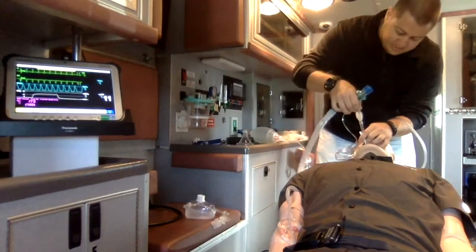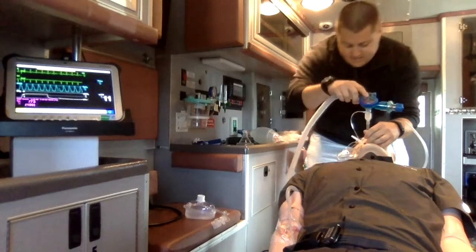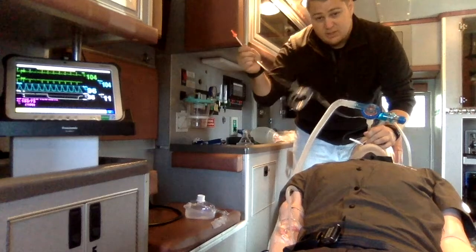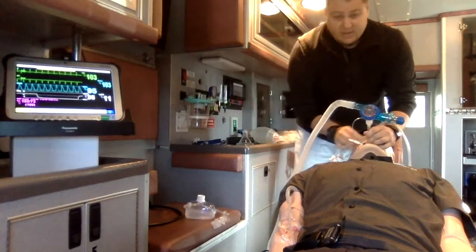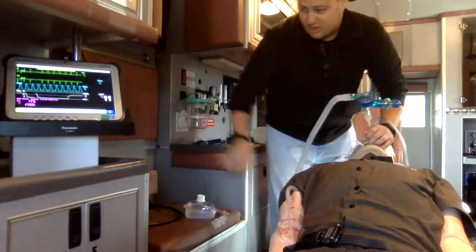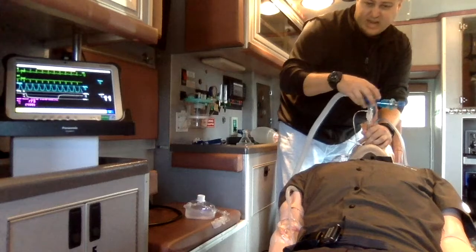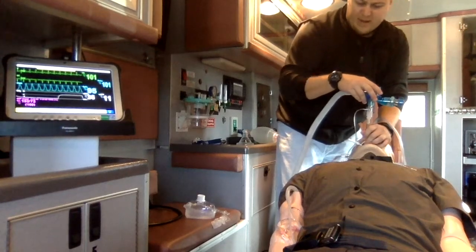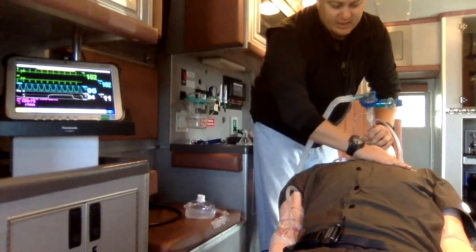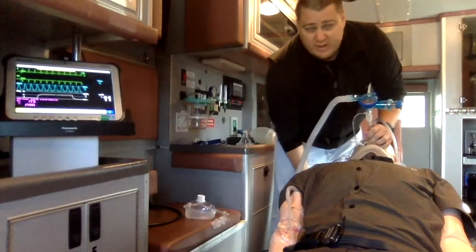Tube end tidal is going to be placed. Ventilator circuit that was left on going to be reattached. Going to now attach the tube end tidal, since nasal end tidal will no longer be functioning since I do have a secured airway. So plug all the things in. Respiratory rate again is 16 to 18, controlled by the vent circuit. Tidal volume is about 480. I got good rise and fall of the chest. Lung sounds are still diminished, although I'm starting to hear some air movement.